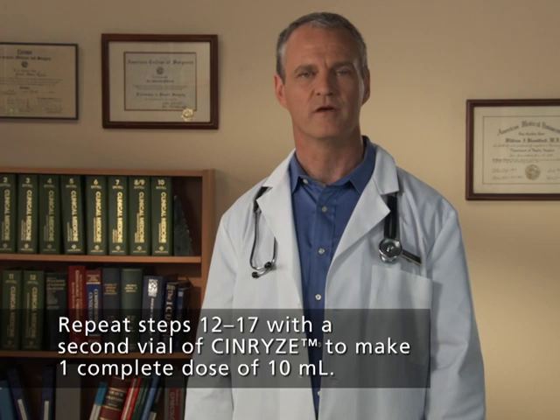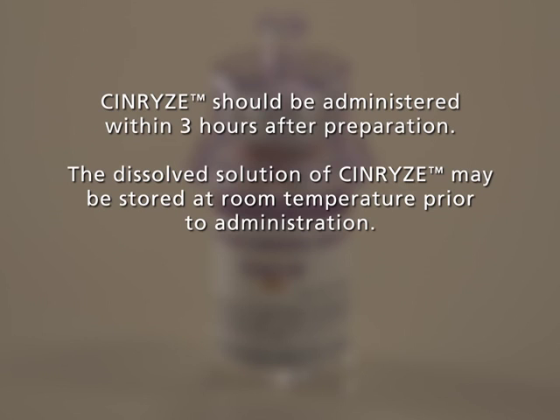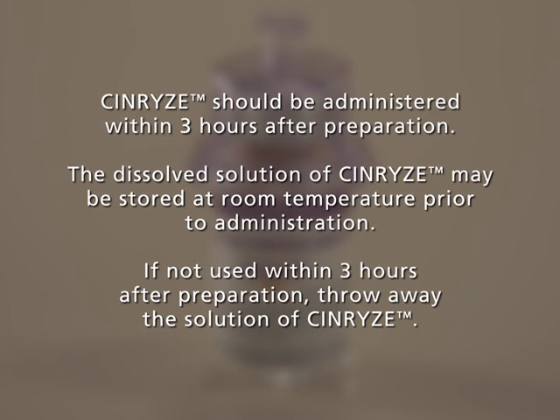Repeat steps 12 through 17 with a second vial of Synrise to make one complete dose of 10 mL. Step 18. Dispose of the vials with the Mix 2 vial transfer device attached to them. Note: Synrise should be administered within 3 hours after preparation. The dissolved solution of Synrise may be stored at room temperature prior to administration. If not used within 3 hours after preparation, throw away the solution of Synrise.